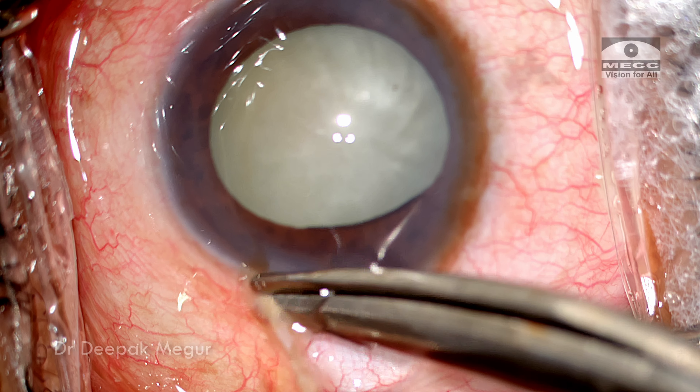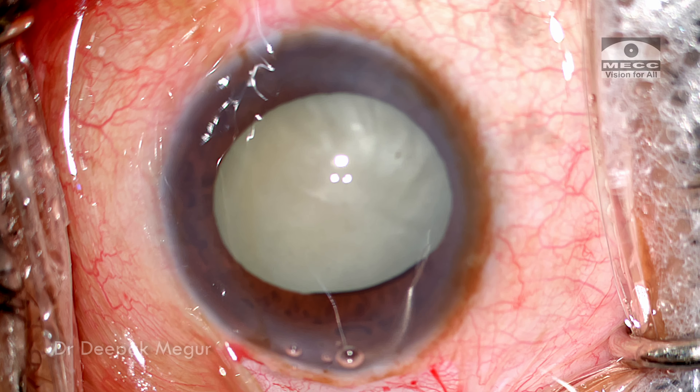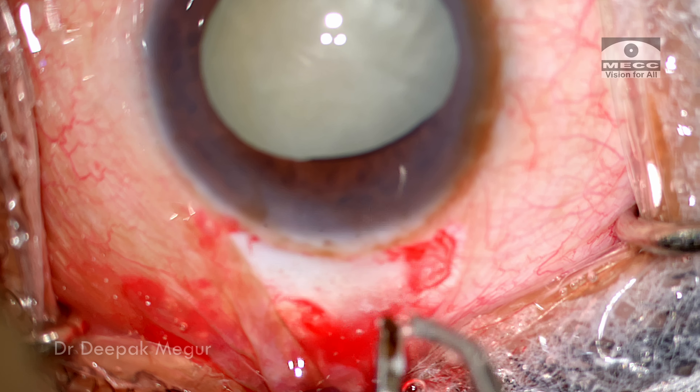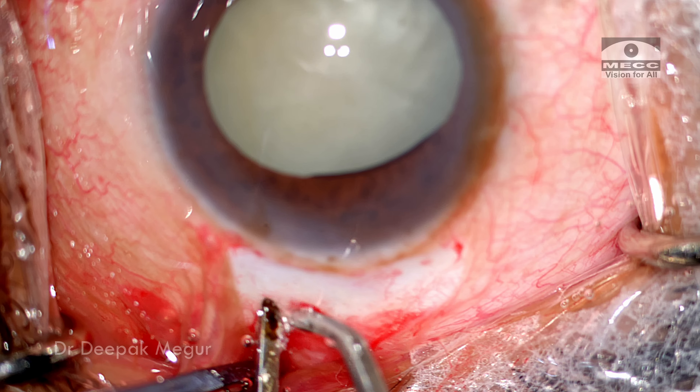The conjunctival flap is created and the bleeding superficial episcleral vessels are cauterized. This will help me to see well.